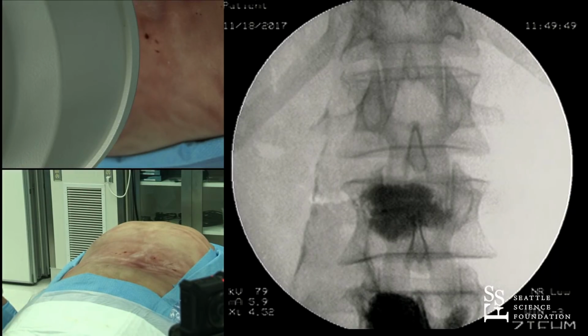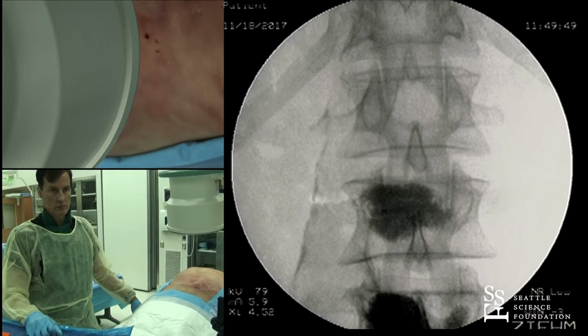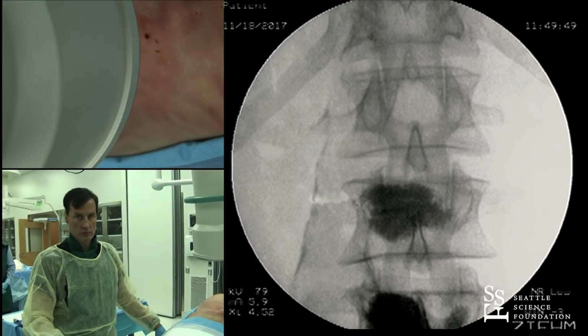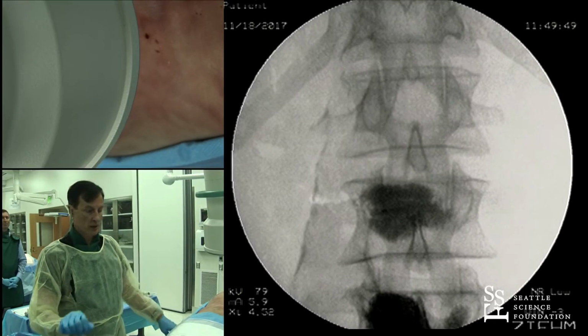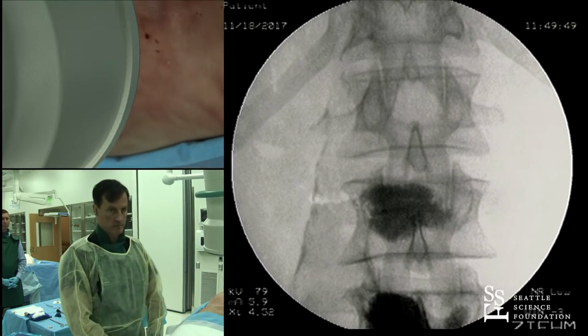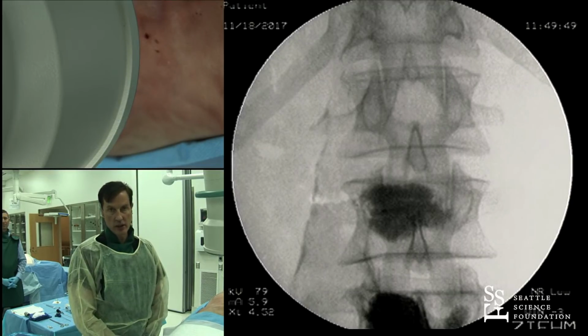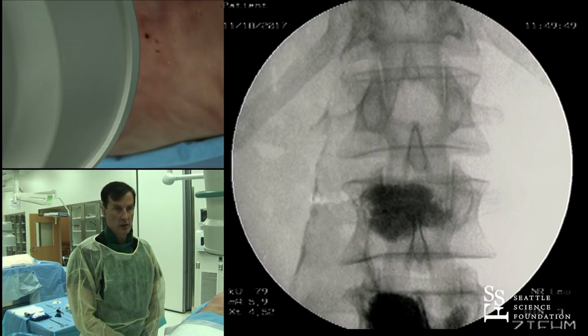Doug, would you agree that for a balloon kyphoplasty, either bipedicular or unipedicular, a lumbar or lower thoracic vertebral body would benefit from 6 cc's of cement as an approximate volume, and this might take less? Yeah, that's right. If you have roughly 2.5 cc's of cement space occupied by implant, you can put less cement in. The real important point is there's enough support, top to bottom, left to right, inside the vertebral body to function as an intervertebral strut.